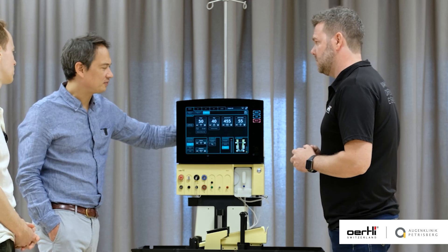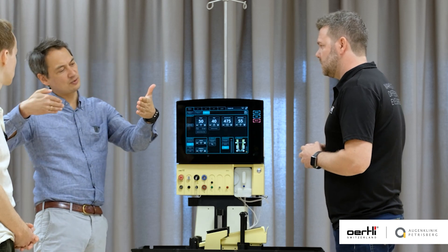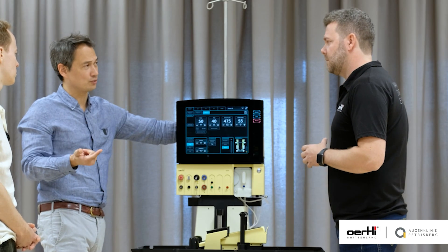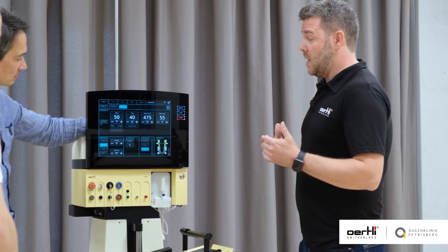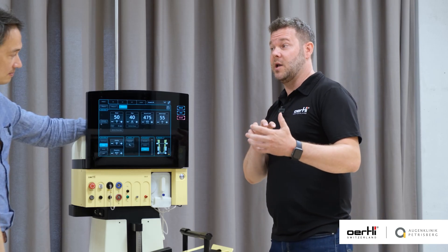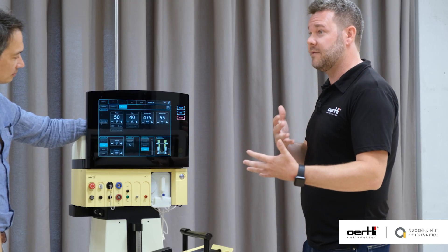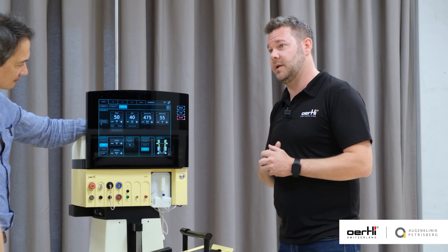But if you crank vacuum up to 550 and have an occlusion, isn't there a danger that you suck in the nucleus all the way to the capsular back? Or is there a way to control the high vacuum once you reach occlusion? It's a good question and it depends a little on the eye. Especially when working with a very hard nucleus where there is no cortex left and you're eating the last fragment, you need to watch out and maybe reduce the flow and vacuum a little. But for a standard European cataract where you still have some cortex cushion left, usually the fluidics do the job and you don't need to be afraid of the capsule coming, even with higher fluidics.